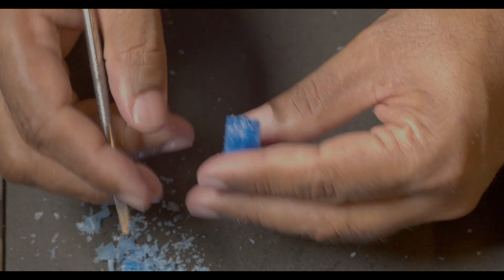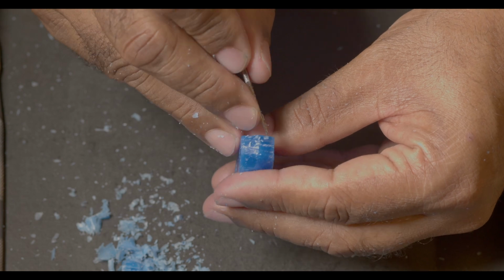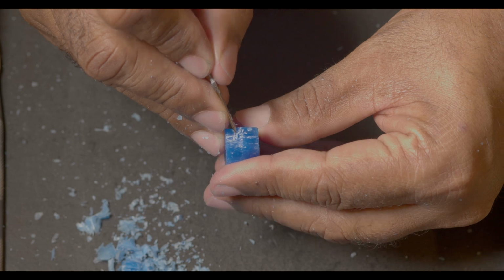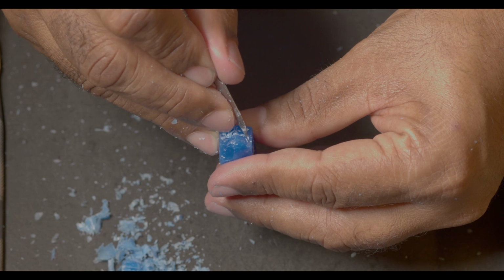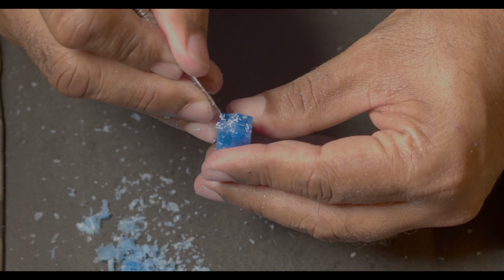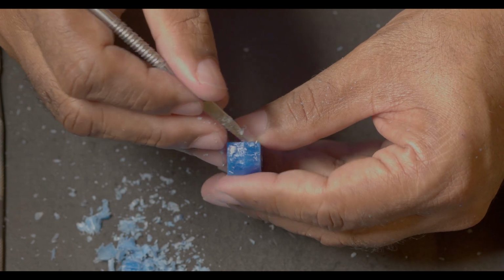Now here what we have to do is, we know that the outline is squarish and that we have 2 cusps on the lingual side. So here we know that the distal lingual cusp is the smaller of the 2 on the lingual side. So this will be a line of reference. We have a Y-shaped pattern in this cusp. So from here you should have a sort of a Y pattern. So roughly draw a Y pattern for a reference. And you will know that this is supposed to be the smaller distal lingual, this is the larger mesiolingual.